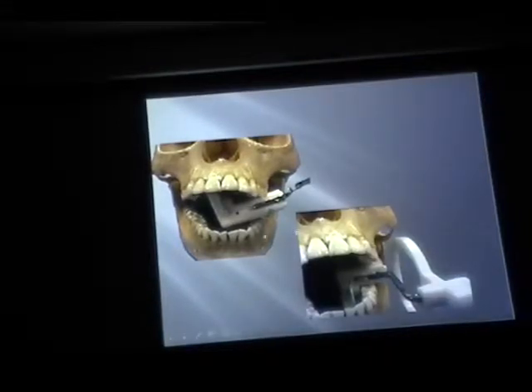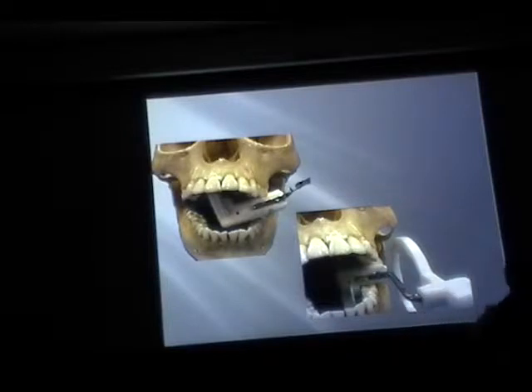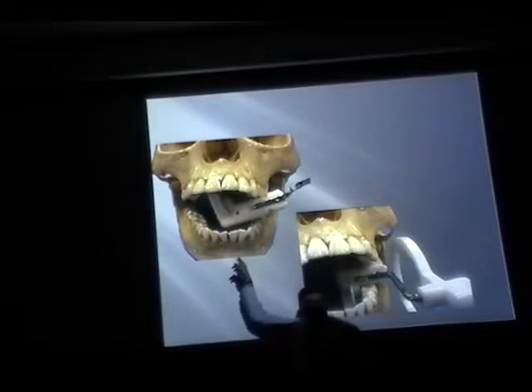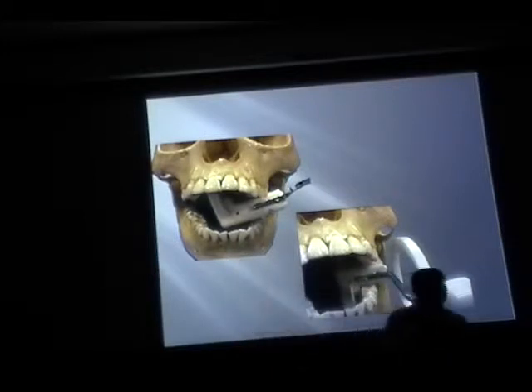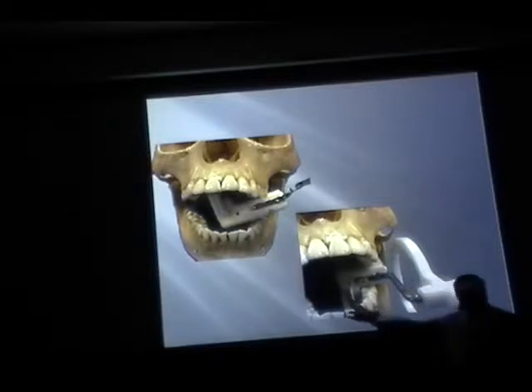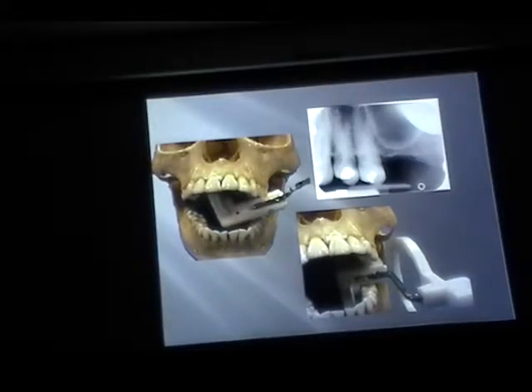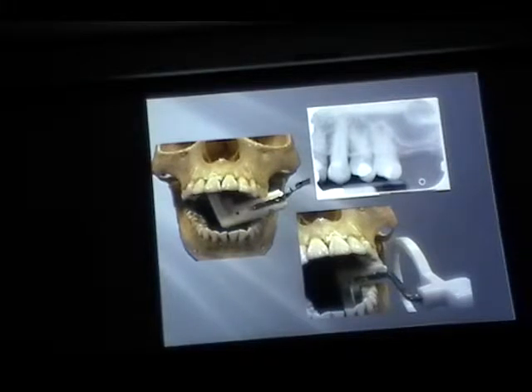So like here, this is an example. Again, there could be some exceptions, right? If there is a very shallow palate, then we do not have a choice, right? Then in that scenario, you may have to place the receptor like here in the midline region. So that's the best for that particular scenario. But you try to place it as close to the teeth as possible. So that's the difference.